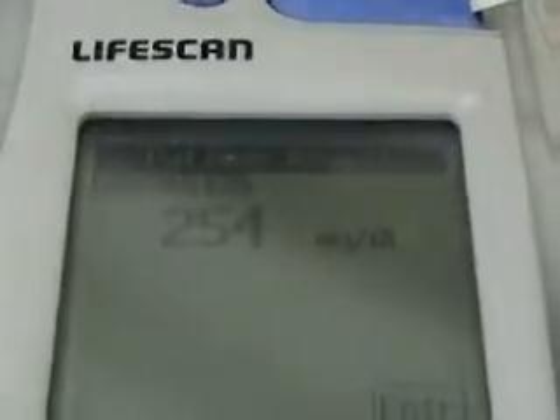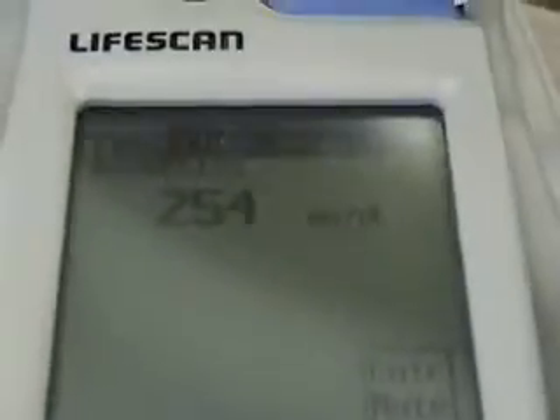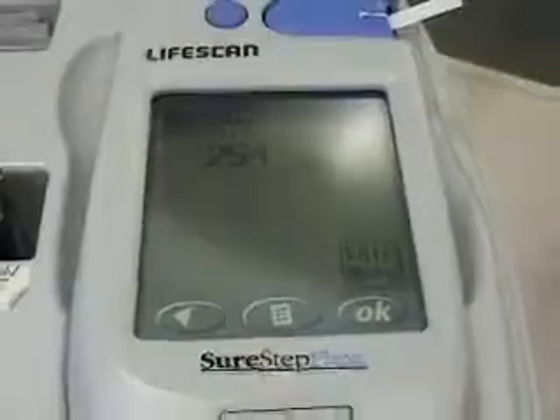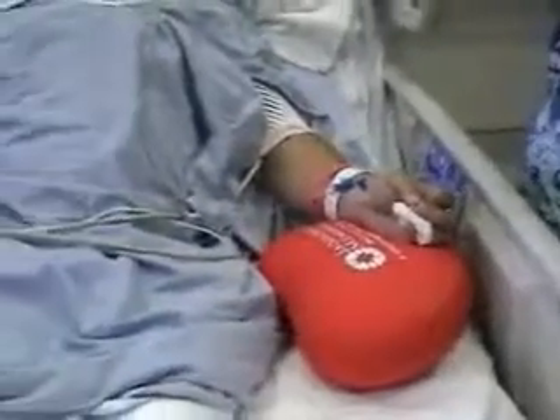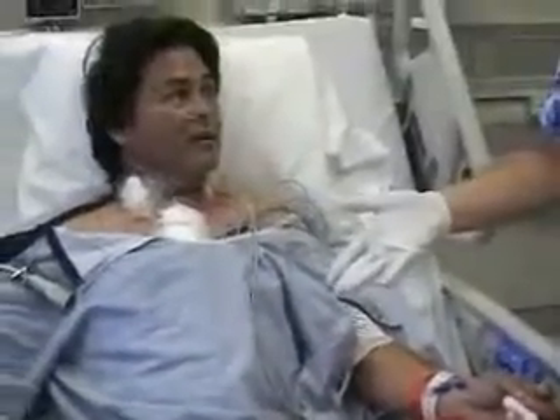I'm going to give you the result — it's going to come up, and then that will be your blood sugar level. There you go — it's a little high: 254. So we will cover that with the sliding scale before he eats. And that's it. How was that? There you go.